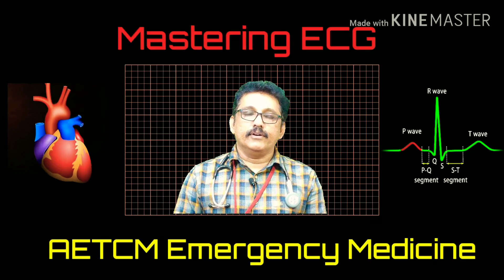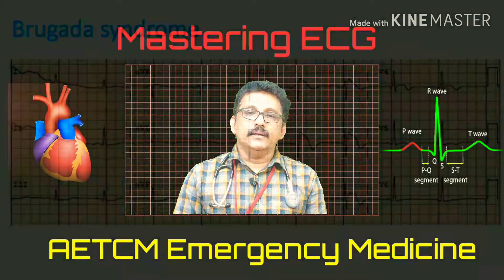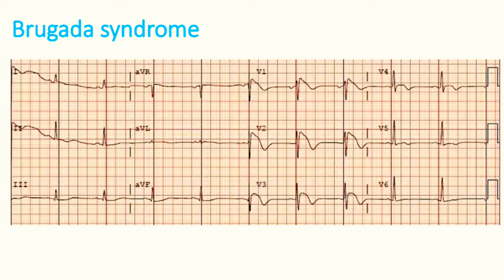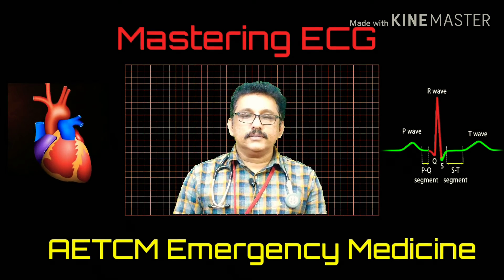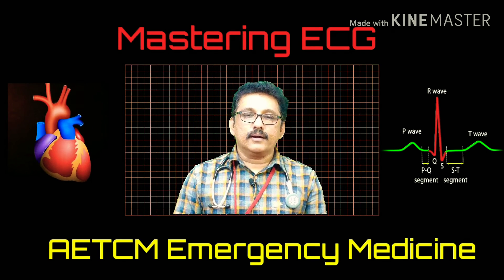Another syndrome where you get T-wave inversion is something like RBBB — that is called the Brugada pattern. If the patient has a history of sudden cardiac death or arrhythmias, then you can call it Brugada syndrome. In this ECG you can see minimal ST elevation in V1, V2, V3, followed by T-wave inversion after the ST elevation. If there is no prior history or family history of sudden death, it is called Brugada pattern.